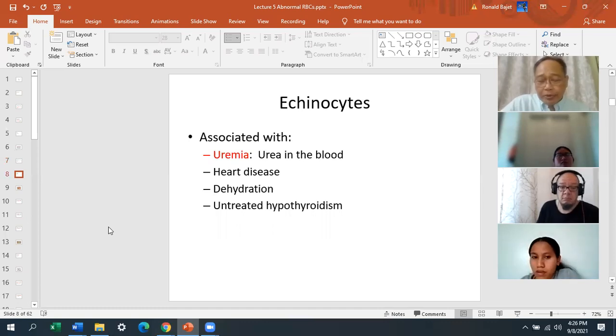Conditions that produce echinocytes include uremia. That's urea in the blood; you don't want too much. Others are heart disease, dehydration, and untreated hypothyroidism. So it's your water imbalance. Usually it's caused by water imbalance like dehydration.